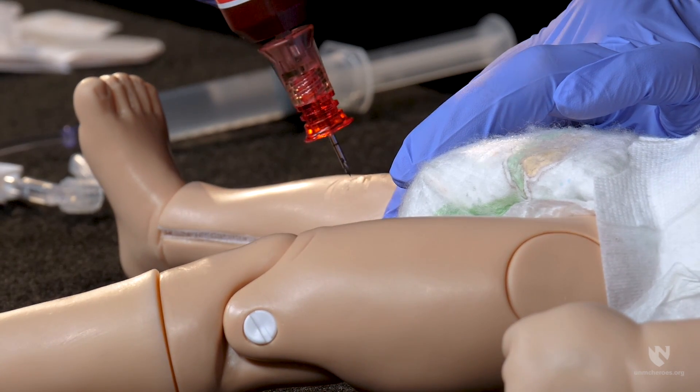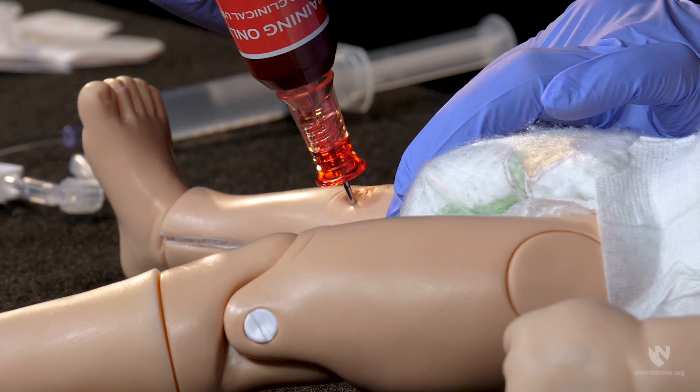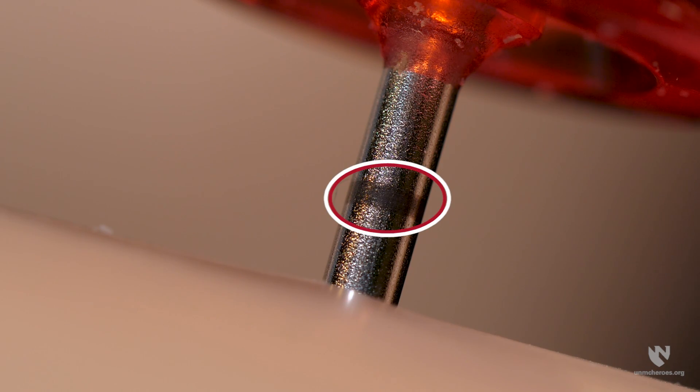Stabilize the limb and gently insert your needle into the soft tissue. The five millimeter black line should be visible above the skin. If you cannot visualize the five millimeter mark before you enter the bone, a longer needle is needed. Not having the proper needle length could result in tissue infiltration or extravasation.